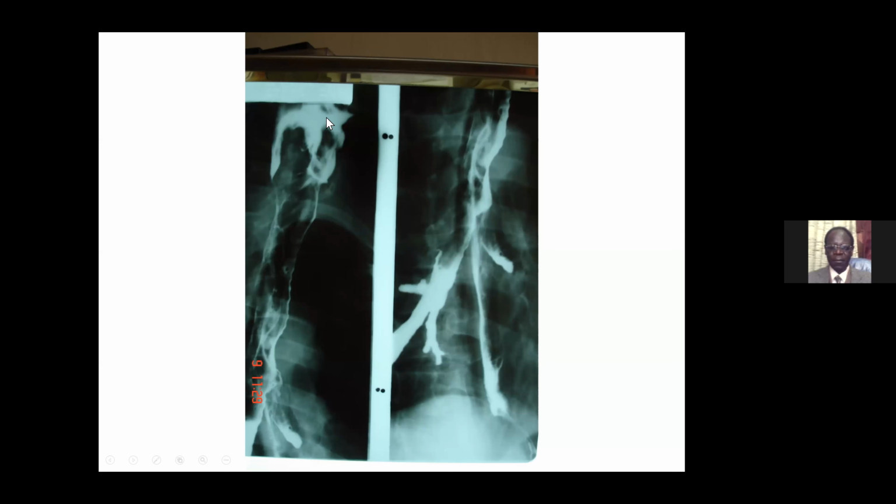In this patient, we were doing a barium swallow, and the patient would try to swallow, and the contrast would end up going into the trachea. Some of it will go into the trachea, some of it will continue in the esophagus. It had been there for quite some time. You can see hold up at that level there, upper 1/3. So there is a tracheoesophageal fistula, a complication of CA esophagus.